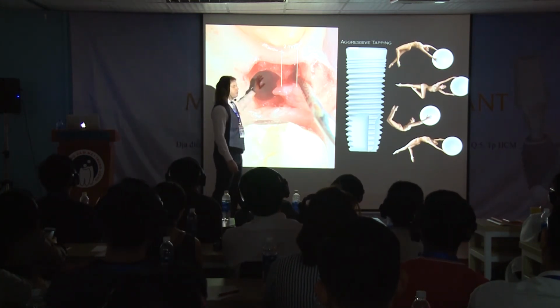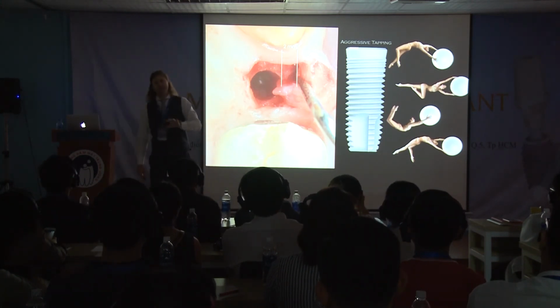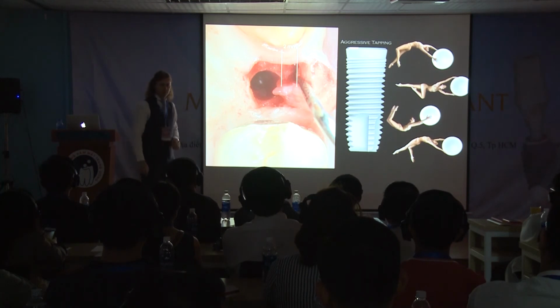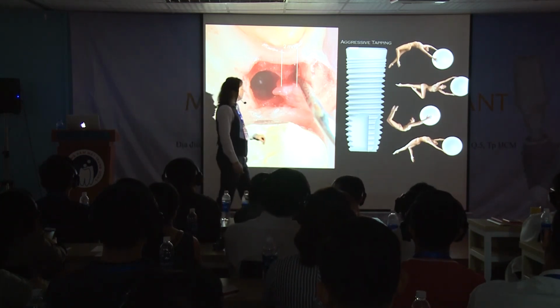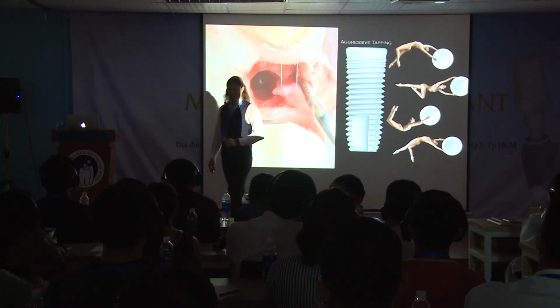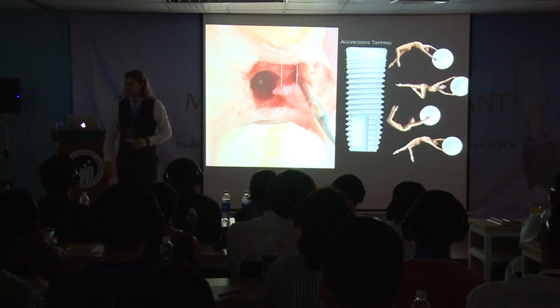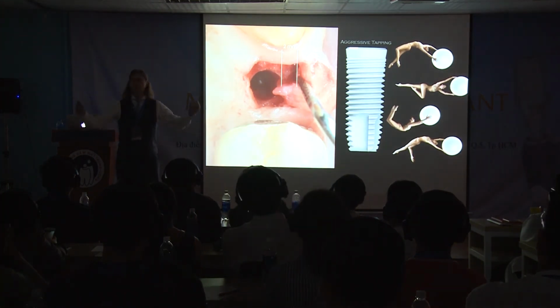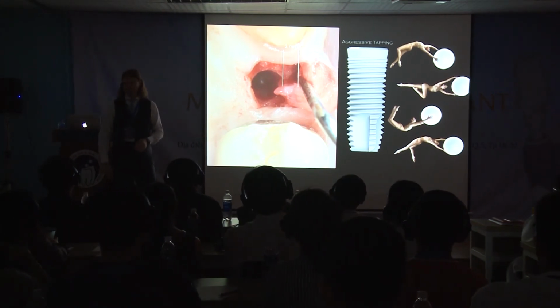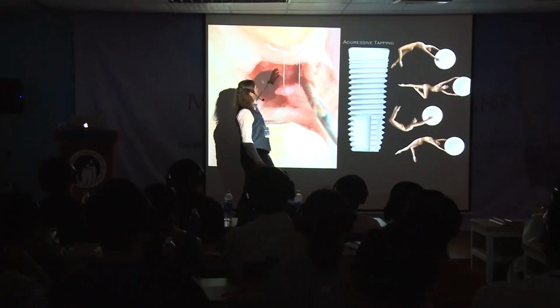You make a hole of 3 or 3.25 millimeter. And you put an implant of 4 millimeter. What happens to the bone? Will it be expanded or grinded? The tapping part will destroy the bone.